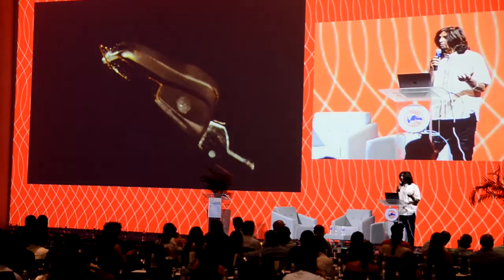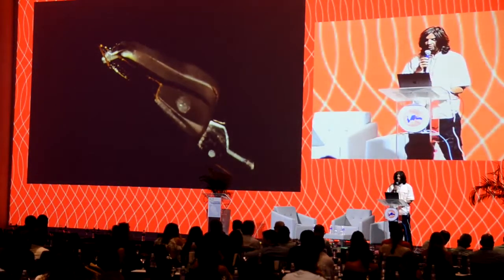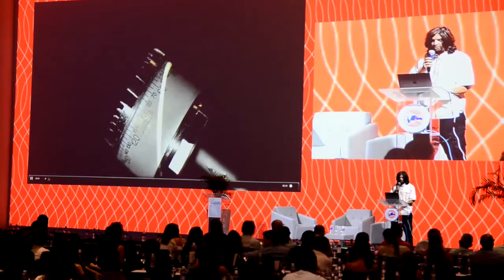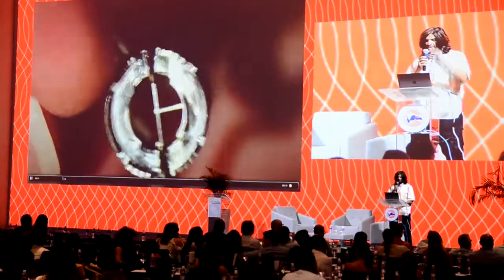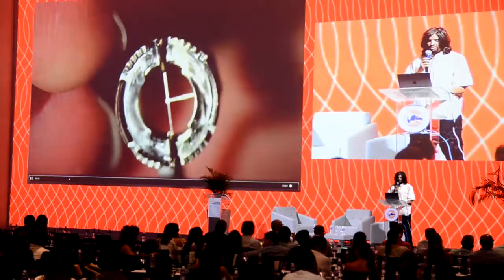We can use metal blades, we can use diamond blades. I love diamond blades. This is a specially designed blade we have at the slit lamp with a foot plate on it. And here's what it looks like basically. We have the rotatable two-ray marker. I can rotate it to the axis of where I wish to place the arcuate incisions. I have the teeth identified here.